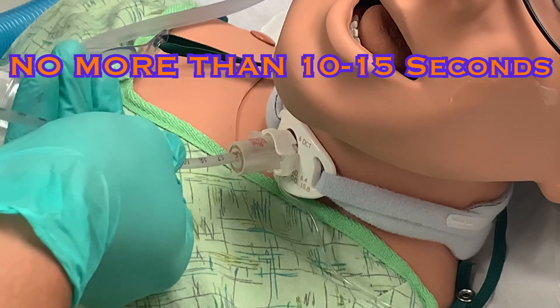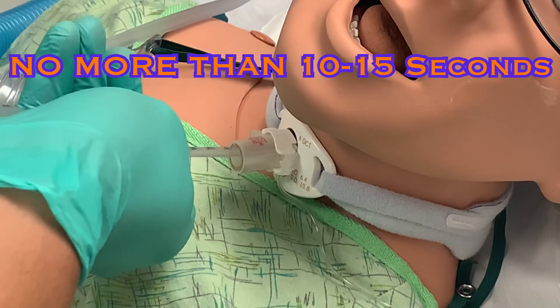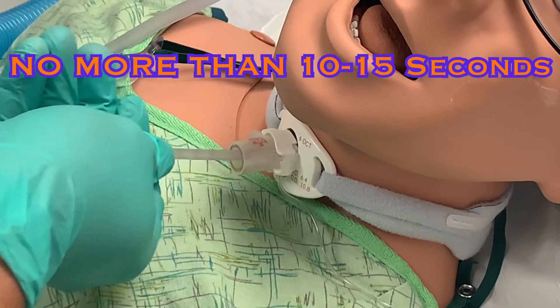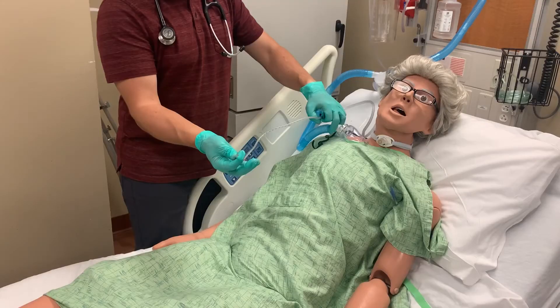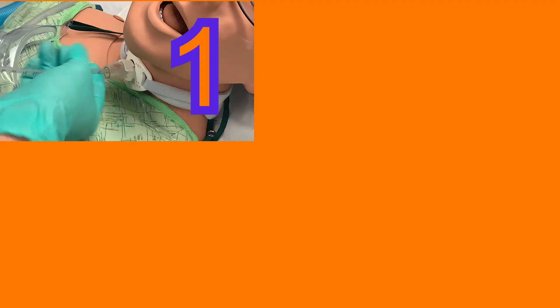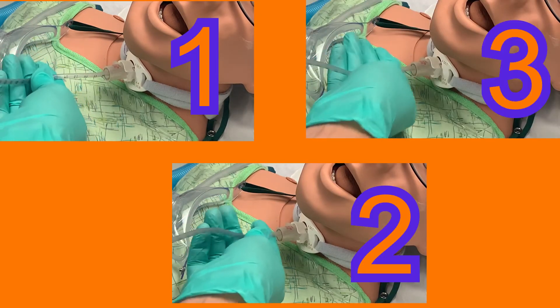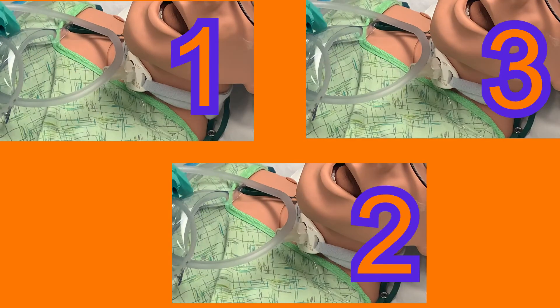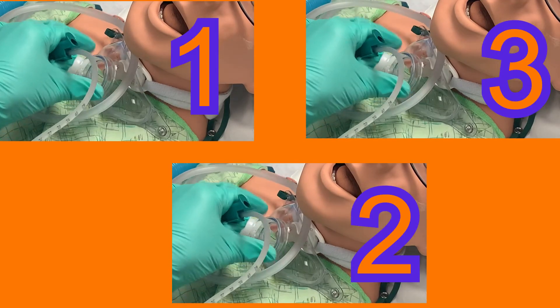Be aware that while you are suctioning, your patient is not able to draw breath, so a suction attempt should never last more than 10 to 15 seconds maximum. When the catheter is removed, hold it in your dominant hand and replace the collar — which should still be delivering 100% oxygen — with your non-dominant hand. You can suction up to three times, but often one attempt will be enough. If you are performing multiple attempts, make sure to reapply oxygen between each attempt.